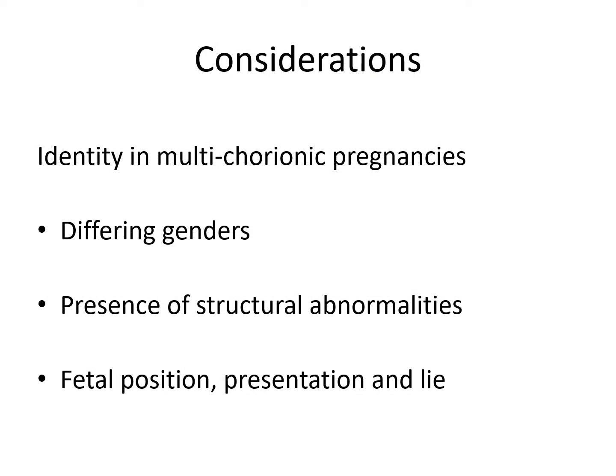Now, one should keep in mind these considerations when you're scanning multichorionic pregnancies. Keep in mind that multichorionic pregnancies are considered fraternal multiples, so they may have differing genders. There may be the presence of structural abnormalities in one or more of the fetuses, which may be different, and so that may also help you differentiate the fetuses if you are confused about which fetus you are currently scanning. And also the fetal position, presentation, and lie of each fetus helps to clue you in as to which one you are currently scanning.